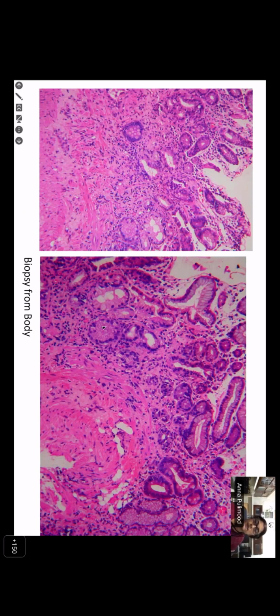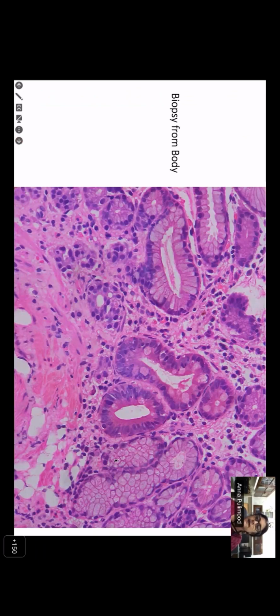But instead here, you're seeing a lot of mucus producing glands. And then you're also seeing, what are these glands? Intestinal like glands, yes, ma'am. Intestinal metaplasia. Yeah, so actually there's a severe atrophy of the body glands, almost total atrophy, no normal body glands. Instead, there's a lot of pyloric or pseudopyloric metaplasia and focal intestinal metaplasia. Okay, so this is the intestinal metaplasia, this is the pyloric metaplasia. And then here, can you see some nests of cells also? Yes, ma'am. Okay, so that's also abnormal.